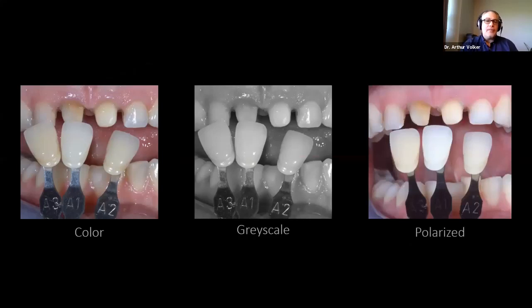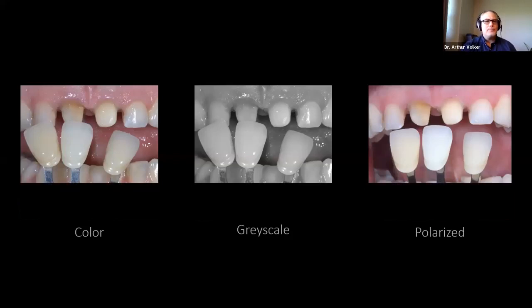And what this is, again, if you look at it, you're giving your technician 9 different options to help make a decision in terms of shade. And we haven't even begun to talk about this color dentition yet. The one thing I'm going to ask all of you, if you want to have good relations with your lab, is when you take a photograph and say, okay, I'm going to do what Dr. Volker said, I'm going to take these pictures, don't do this. I've seen this more times than you would think.